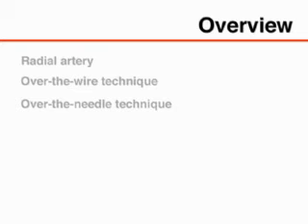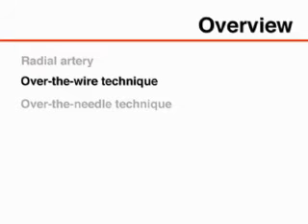This video will demonstrate arterial line placement in the radial artery using two of the many techniques available for arterial line placement: an over-the-wire technique and an over-the-needle technique.